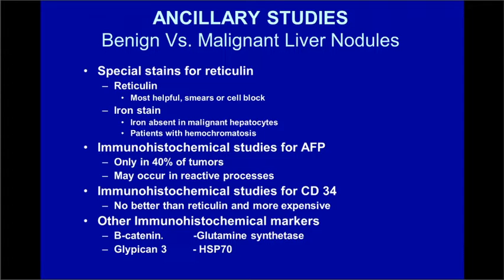Alpha-fetoprotein is expressed by hepatocellular carcinoma. The problem is that only about 40% overexpress or demonstrate expression for AFP in their cytoplasm. So if it's negative, it does not rule out a malignant process.